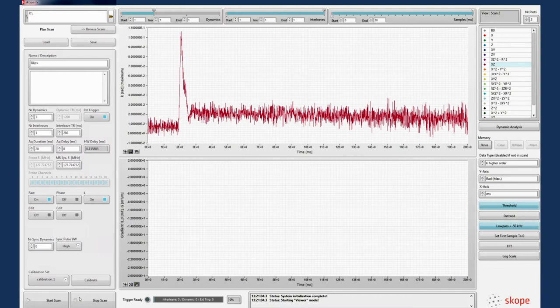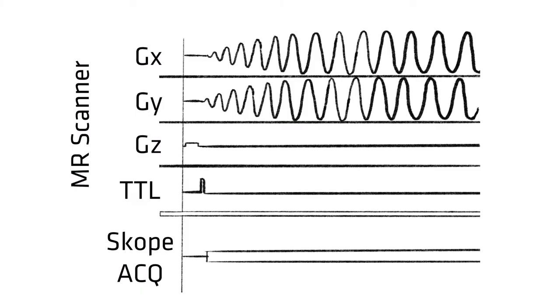Next, let's acquire a real imaging sequence. We will acquire a single shot spiral image at 220 by 220 matrix size. This spiral utilises the full capacity of the gradient's slew rate. The distortions from this single shot spiral are greater than multi shot spirals, which do not require gradients to slew as quickly.